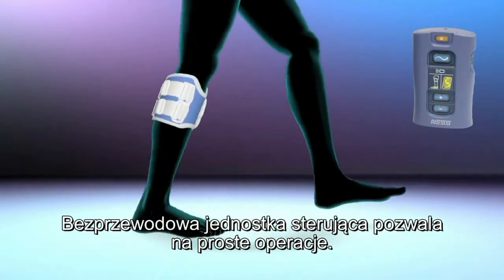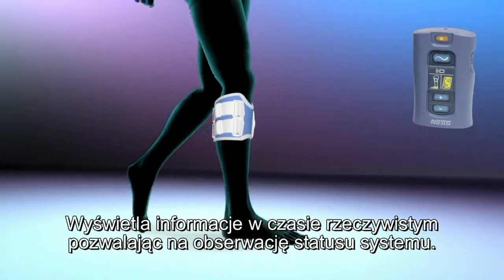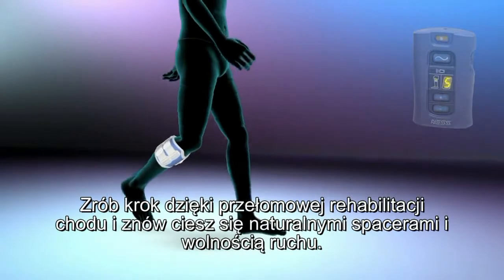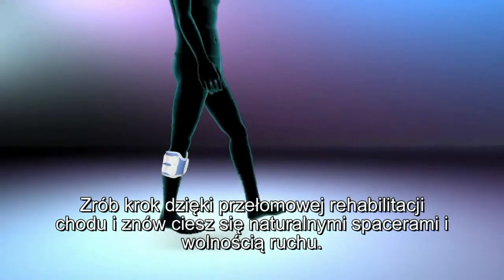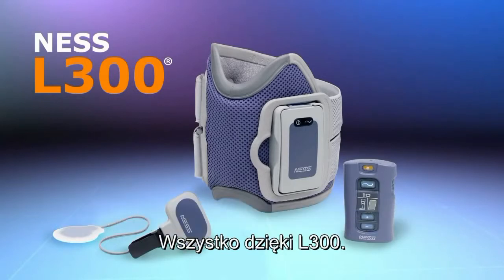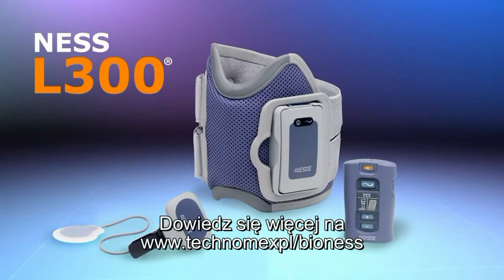The wireless control unit allows simple operation while displaying real-time information regarding the system status. Get in step with the latest breakthrough in gait rehabilitation and enjoy the freedom of walking more naturally with the Ness L300 foot drop system.